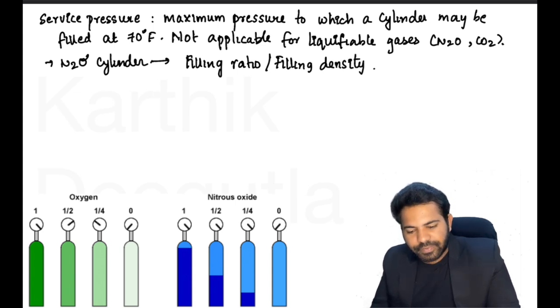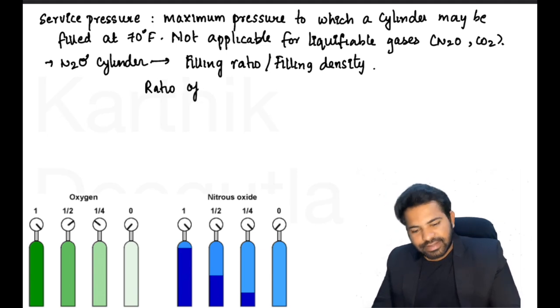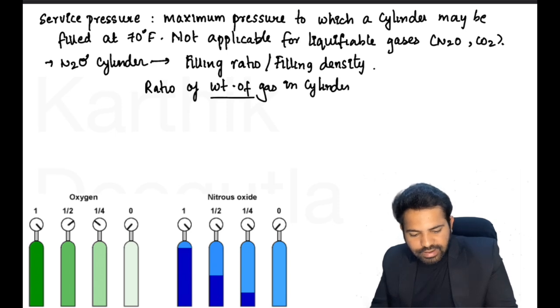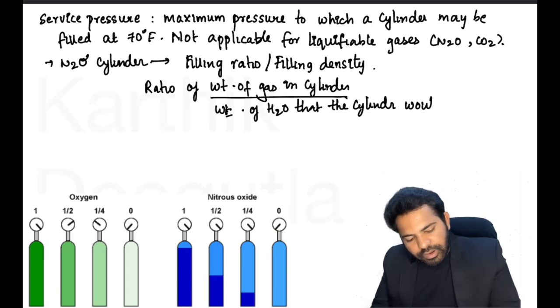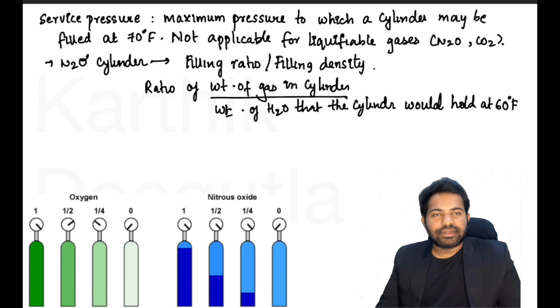What is filling ratio? It is the ratio of the weight of the gas in the cylinder divided by the weight of water that the cylinder would hold at the same temperature, at 60 degrees Fahrenheit.